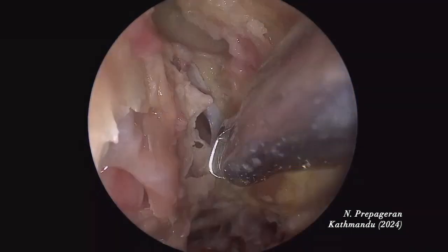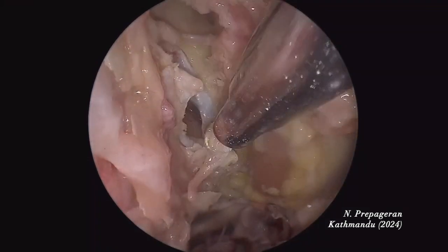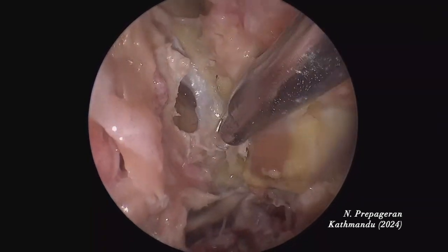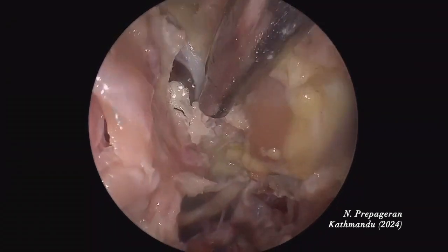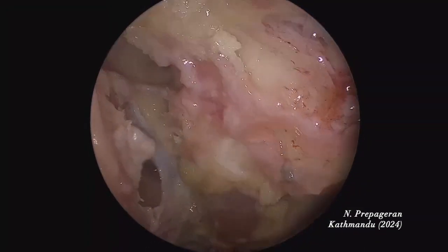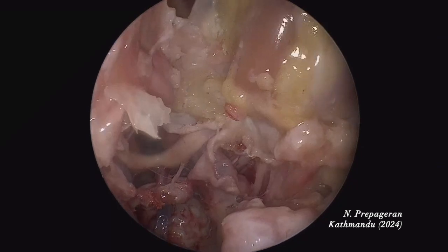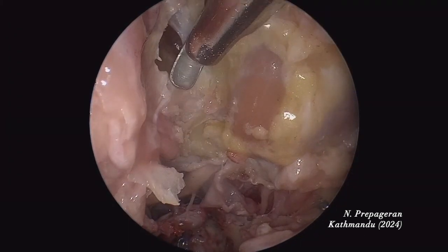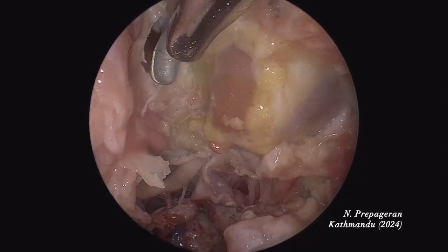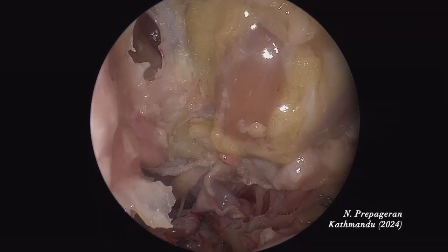I'm going to remove this bone. This dura is very, very thin. I'm removing the bone along the dura. The anterior limit is after the anterior ethmoid artery; the posterior limit is the planum. But it all depends on how big your tumour is — if your tumour is very small, you don't have to remove everything. You tailor-make your surgery.